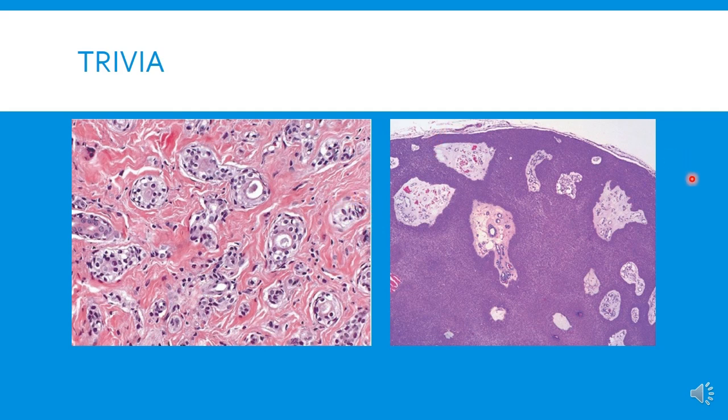And this tumor, if you look at this, it is just a sheet of blue, and there is this vasculature, and if you look very closely, there are these small ductal structures enclosed between these blue sheets of basaloid cells. And if you look from the low power itself, there are some pale cells in between, and there are dark cells in the periphery, and relatively in the center you have pale cells. So what is this pattern and what is this tumor? This pattern is a sheet of blue basaloid cells with entrapped minute ducts, and they seem to be connected with the epidermis. So what could this tumor be?